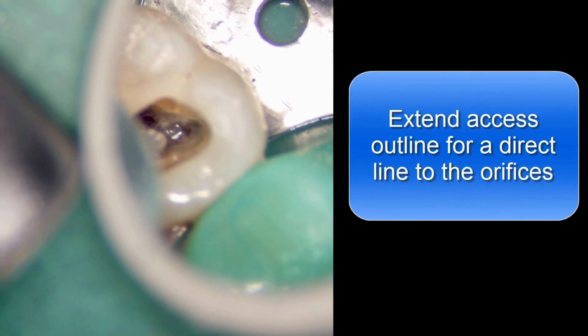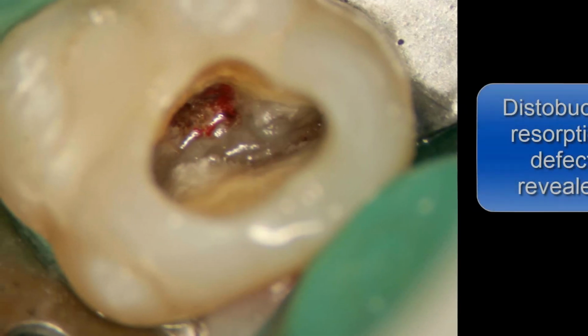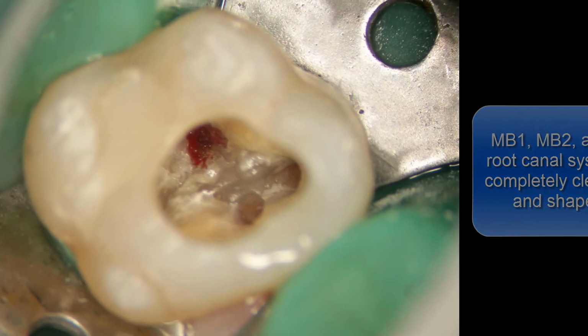In this view, I'm extending the access towards the mesiobuccal line angle and removing some of the pulp stone. Once extending the access and clearing the pulp chamber floor, the resorption defect is revealed. Before addressing the resorbed area, the other root canal systems are completely cleaned and shaped.